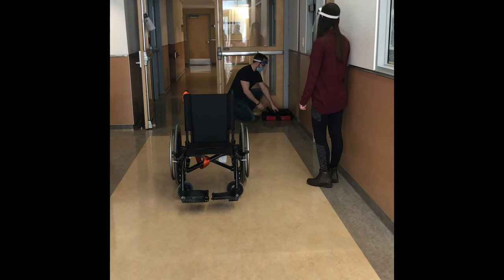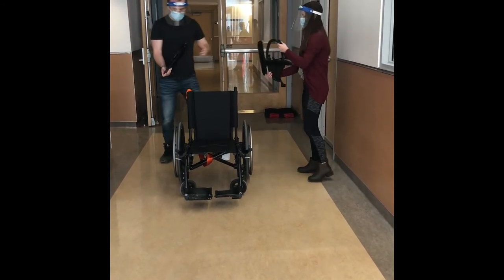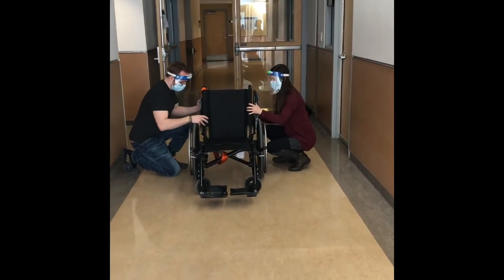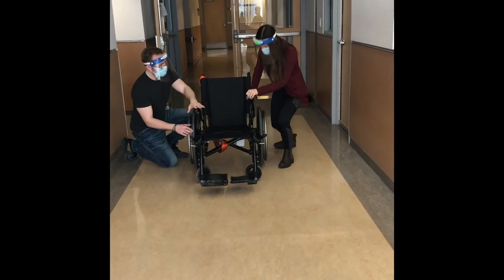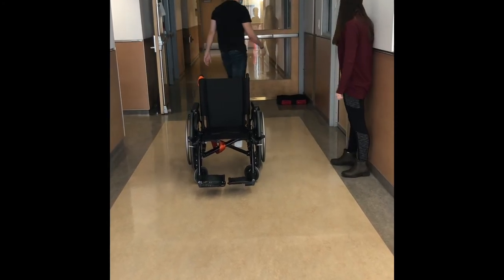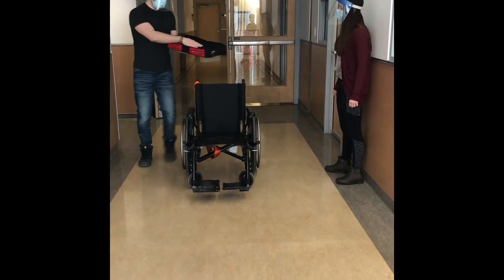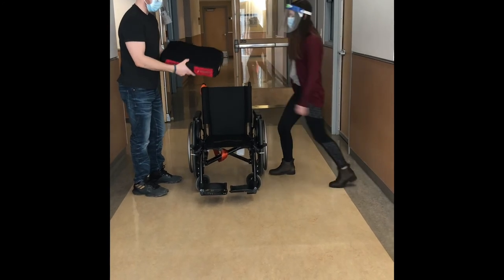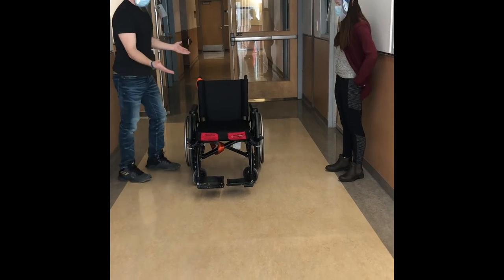Next up, we'll grab an armrest. Same idea — we're going to put it onto the back part here so it clicks in. Make sure you hit that click, and push it forward until it clicks into place. Perfect — now lift it up. Nice and safe. And finally, we'll grab our seat. When you look at the seat, we look for the indents on the front for your thighs, and the back is a little more cushiony for your sit bones — that's how you know the front. Step that out nice and easy, and then you have your wheelchair nice and folded out.